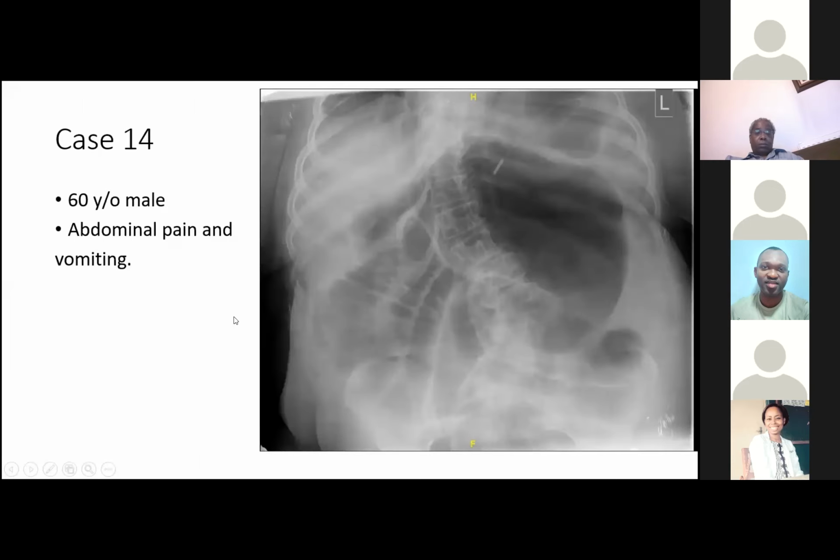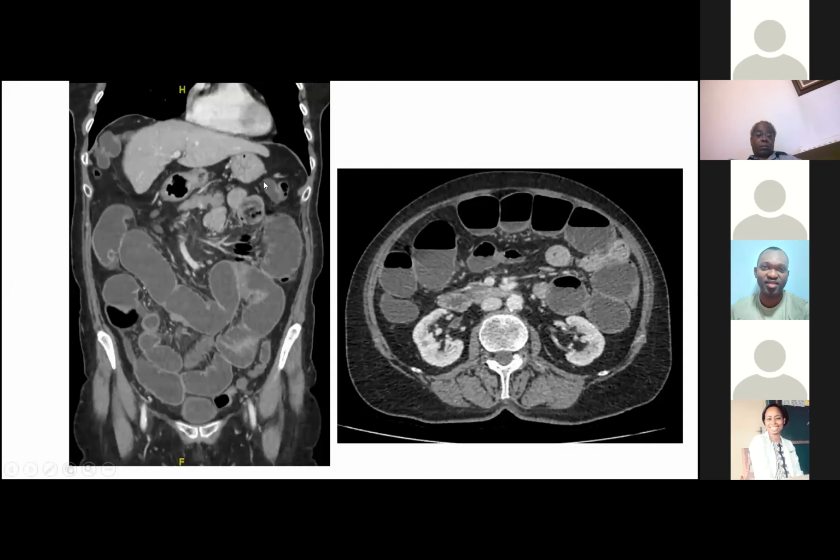Case number 14. Dr. Chasi, do you mind if I ask a question at this point? Sure, yeah. It's about the slide we just saw. If I had this sort of patient at 10 o'clock at night, and I'm not concerned about bowel strangulation or anything like that, would it be reasonable to get a plain film to at least make a presumptive diagnosis, if we need to start suck and drip overnight, and then get a CT in the morning? Is that reasonable, or would you still think that's not very appropriate, rather than just waiting till morning and getting a CT scan?